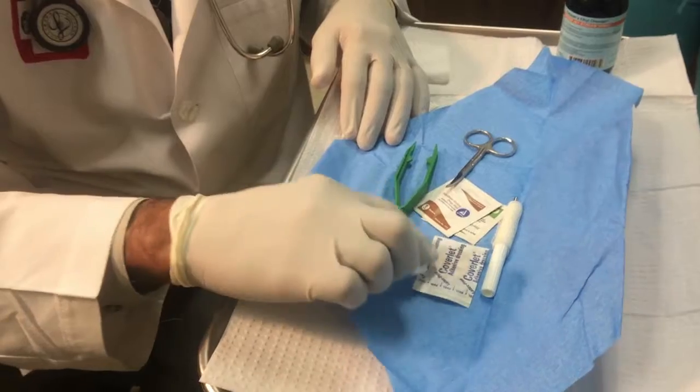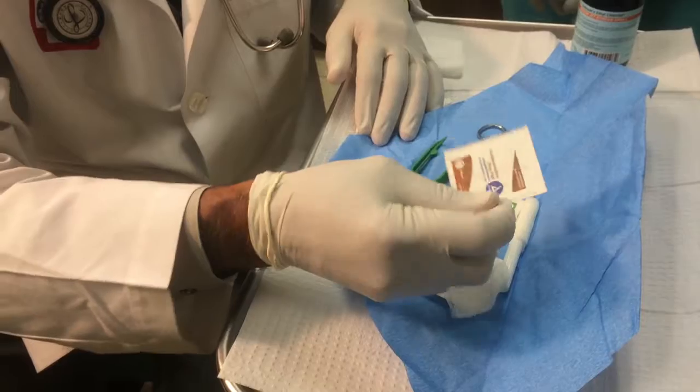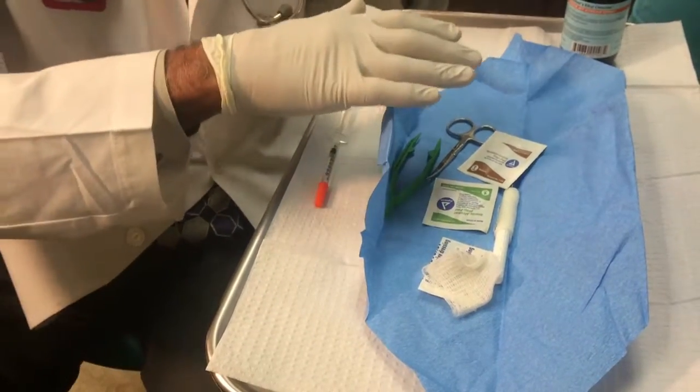We have a circular band-aid to cover it after we have established hemostasis and there is no active bleeding — we can always cover it back. And this is to clean the area properly — it's an iodine pad and an alcohol wipe.